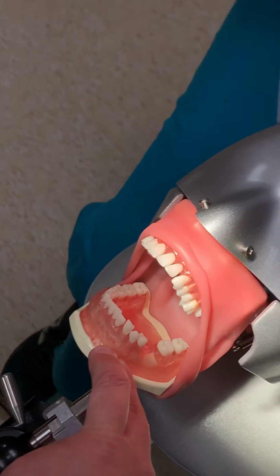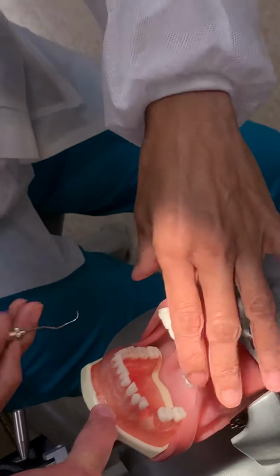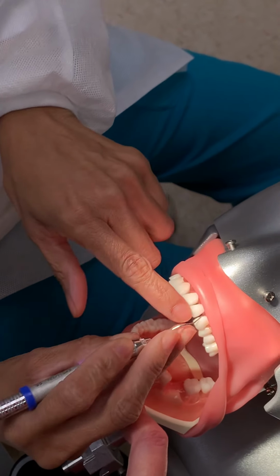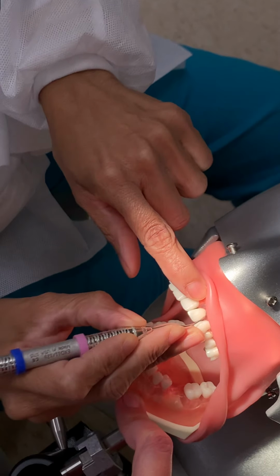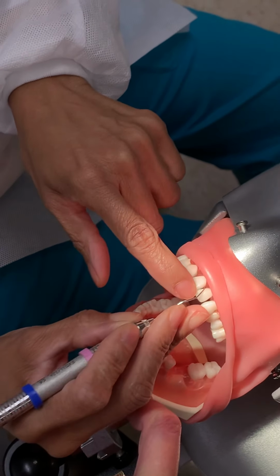And then when I do surfaces towards, I'm going to come around to 8 to 9. Turn my patient's head towards me a little bit. Same thing, like she said, your terminal shank is going towards the tooth. Tip third, and come in approximately like this. Terminal shank going across that tooth.